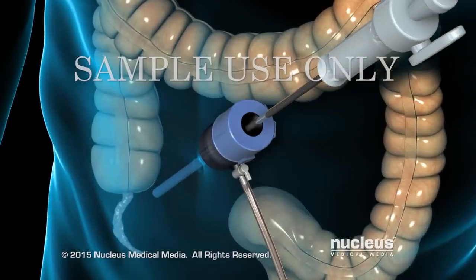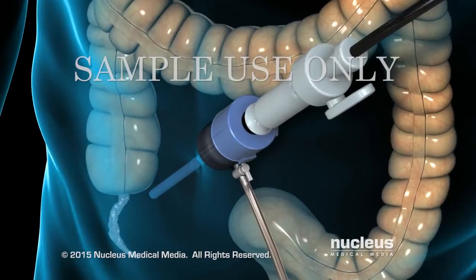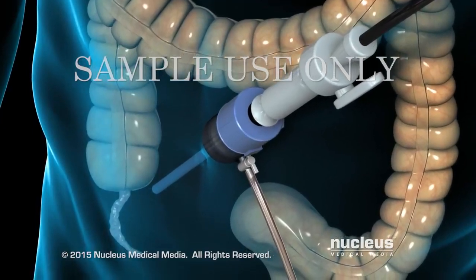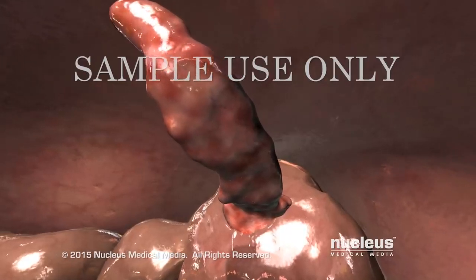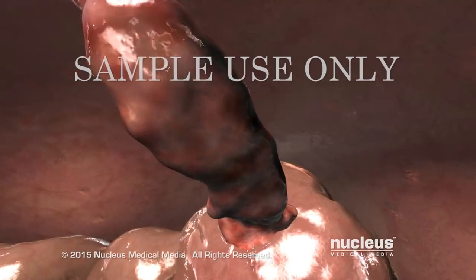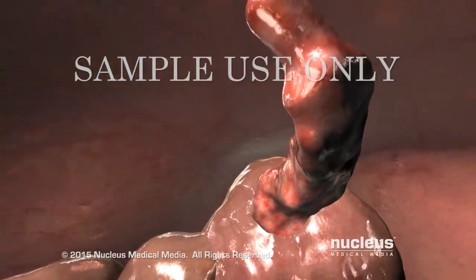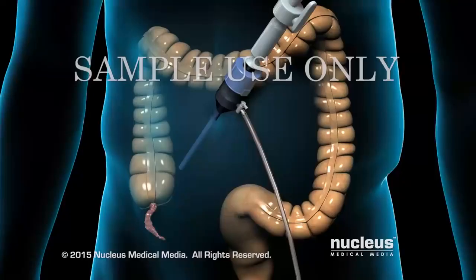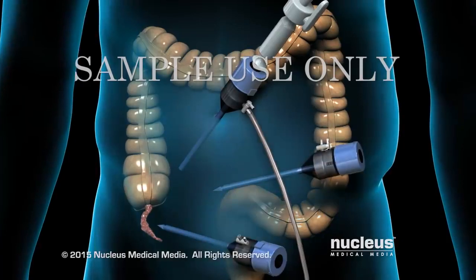Next, your surgeon will insert a laparoscope through this port. The laparoscope is a thin tube with a tiny camera on the end of it that projects images onto a monitor to guide your surgeon's work. Using the laparoscope, your surgeon will examine images of your appendix on the monitor to confirm that it's red and swollen. If your appendix needs to be removed, additional ports will be created.